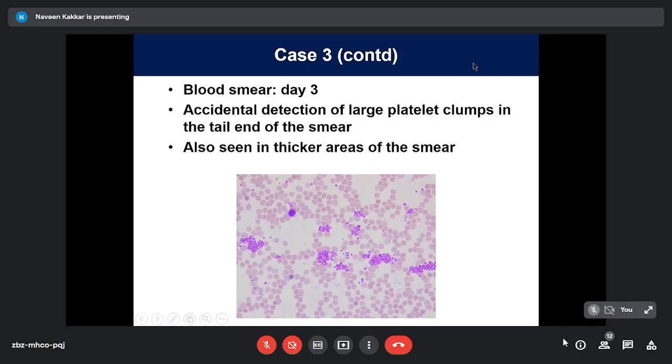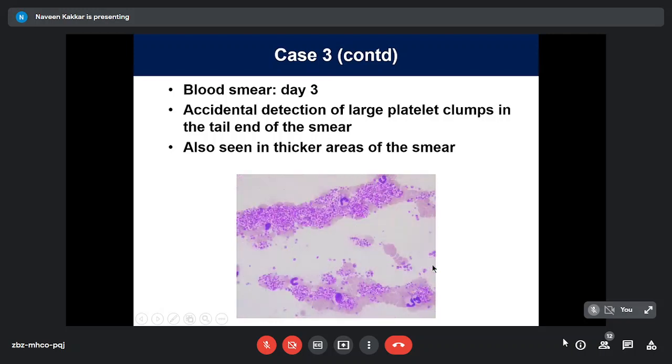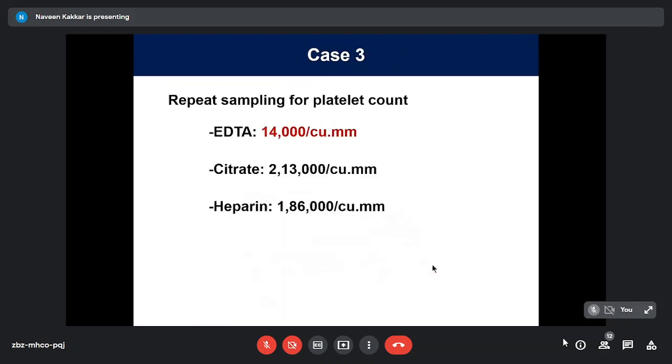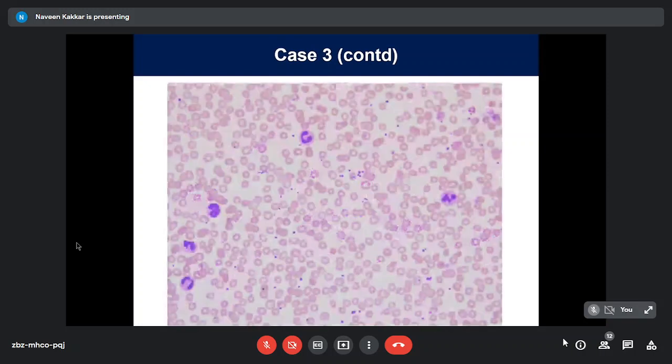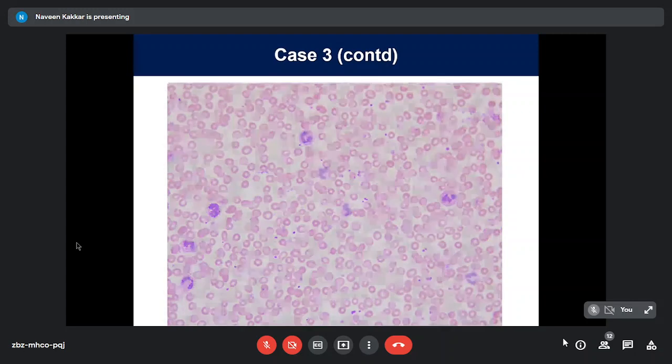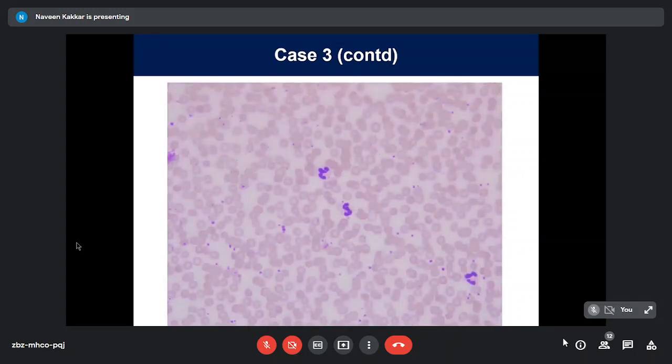This is what was seen. Close to the tail, you can see the empty areas, but large platelet clumps. Very, very huge. Repeat sampling for platelet count was now done in EDTA again, citrate and heparin. And we saw citrate showed a good count. Heparin also brought it up to a normal count. EDTA was still low. That's the EDTA sample, clumping. That's citrate and that's heparin. Citrate and heparin showed no clumping at all.